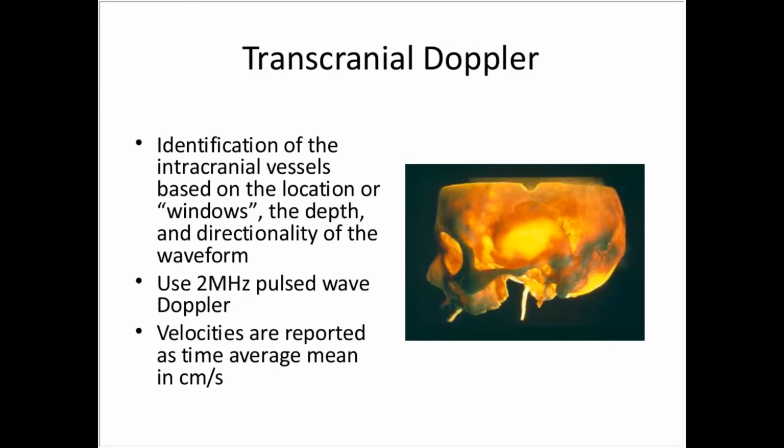Now, we identify the intracranial vessels based on the location or windows, and we also call them approaches. The depth and directionality of the waveform. We use a 2 megahertz pulsed wave Doppler. Velocities are reported as time average mean in centimeters per second.